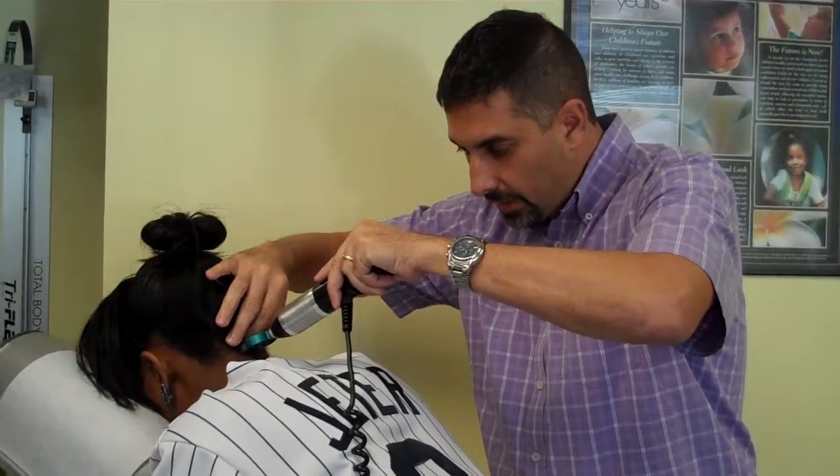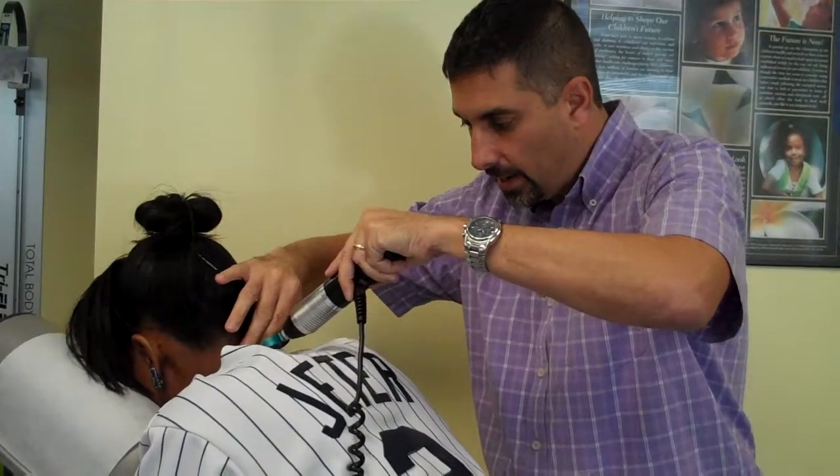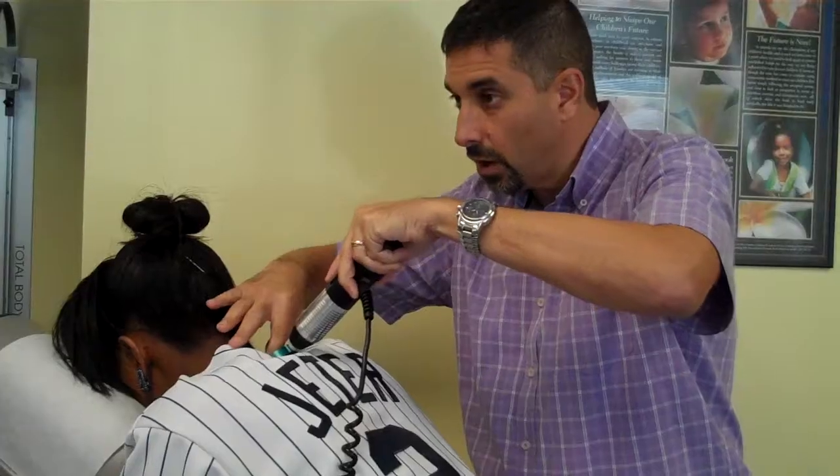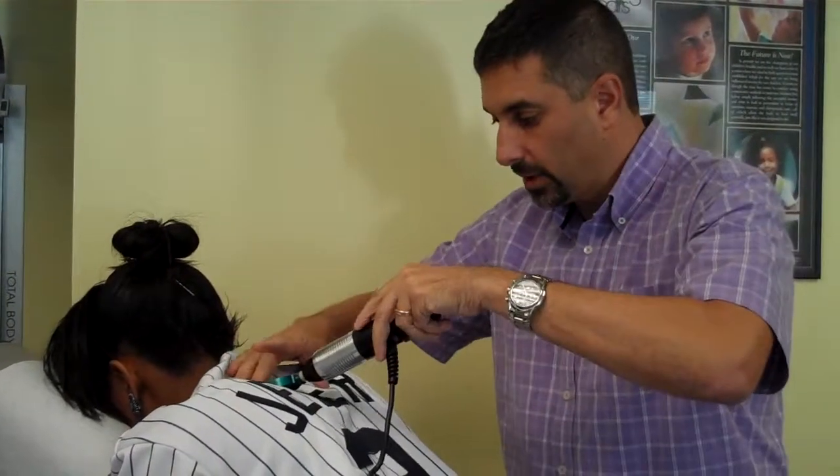you're going to start at your C1 vertebrae, 90 degrees to the spine, keep your fingers off the tip of the instrument, and drop your shoulders.